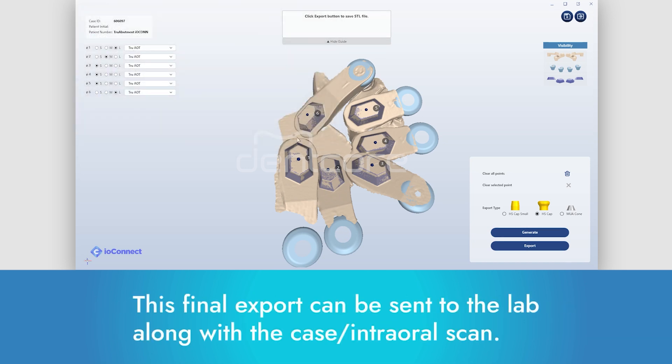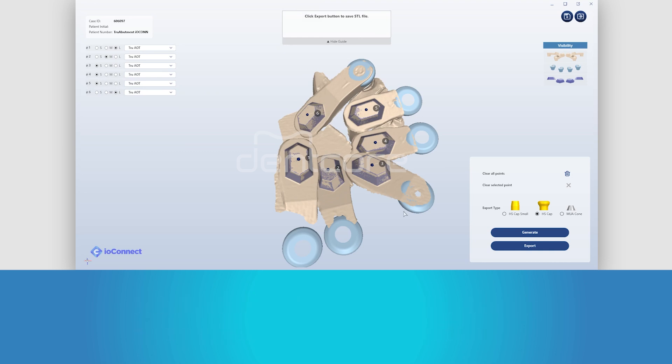This final export can be sent to the lab along with the case / intraoral scan.